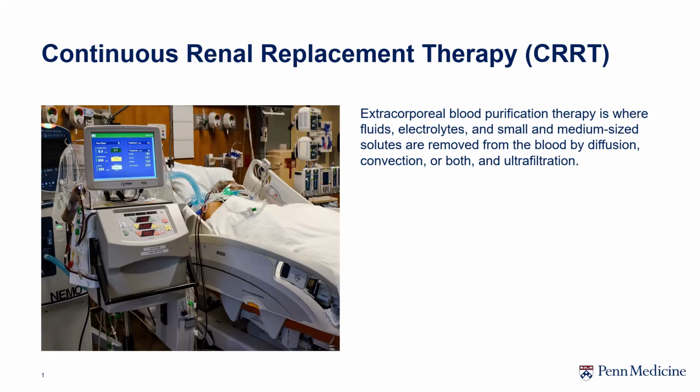This is a quick review of some of the basic principles behind continuous renal replacement therapy, CRRT. Some of the things I'll be going over in this video include what is CRRT, which patients will be getting CRRT, the basic differences between some of the modes we use. I'll be talking about ultrafiltration.